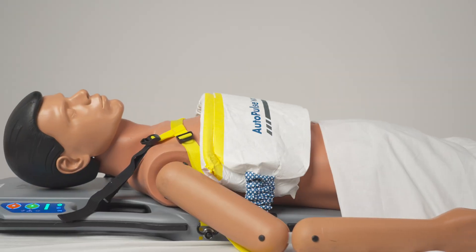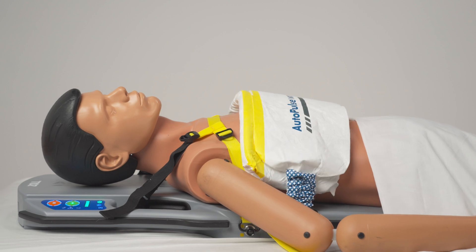We have now reviewed hospital deployment of the AutoPulse NXT Resuscitation System.